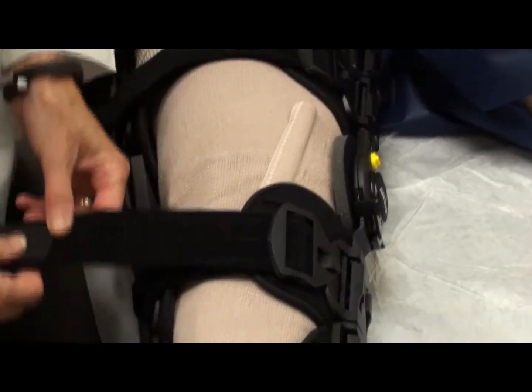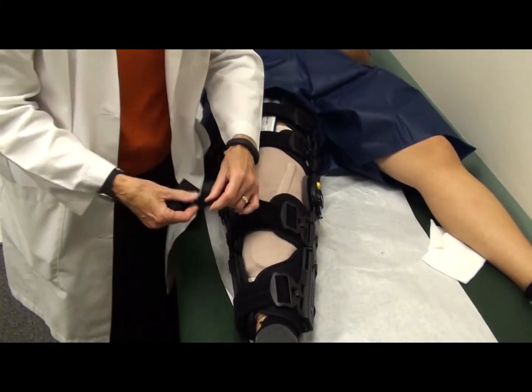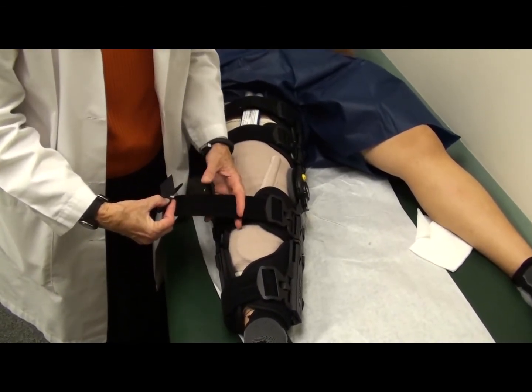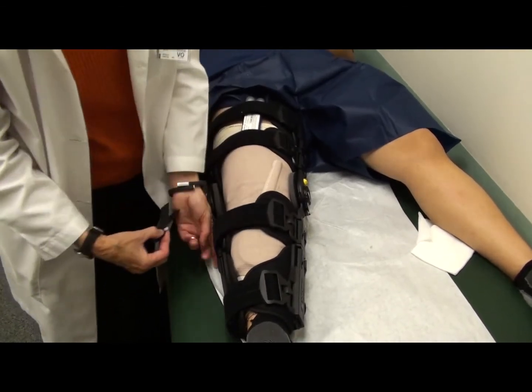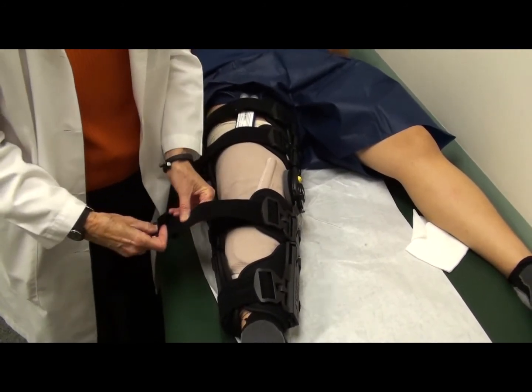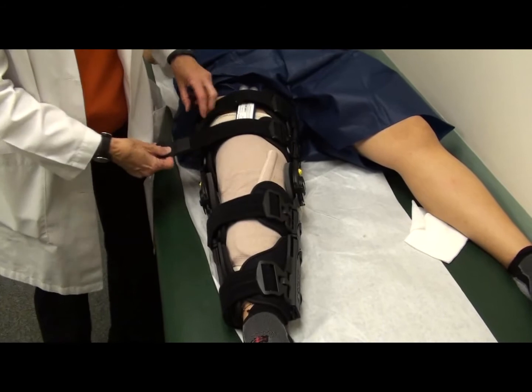These straps can be shortened if they're too long for you, because they do have a little Velcro tab at the end. So you can take off the little sticker, pull it off, cut it. I would really warn you on this one not to cut it too short, but I usually leave them so that they can attach right there, or on the thigh ones I'll cut them up to about there. But on the shin ones I leave them a little bit longer. So you can put that back on and then just push it around the back and it will connect in the back. So that's how your brace is put back together.